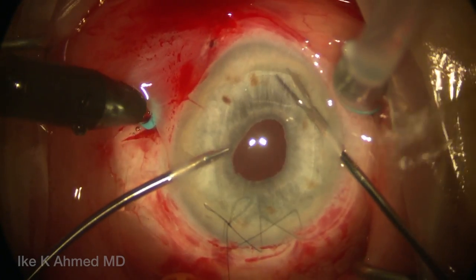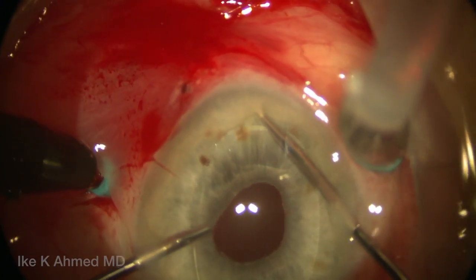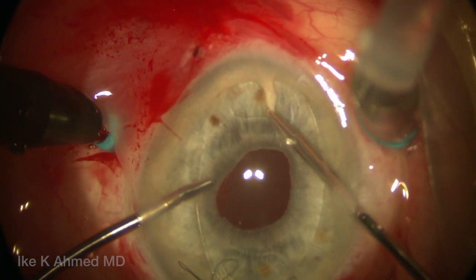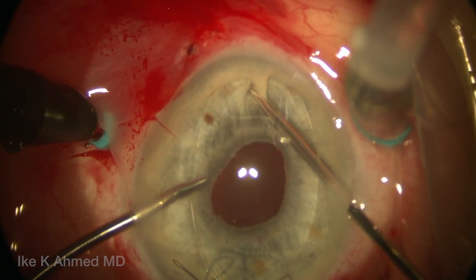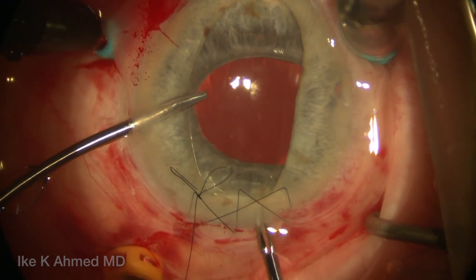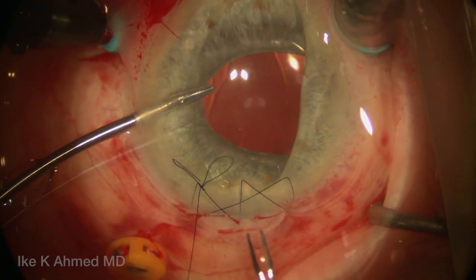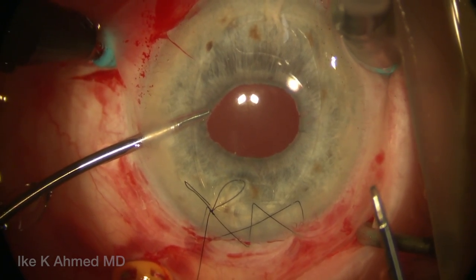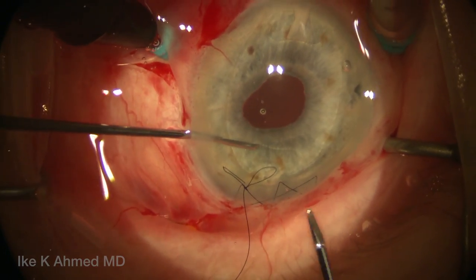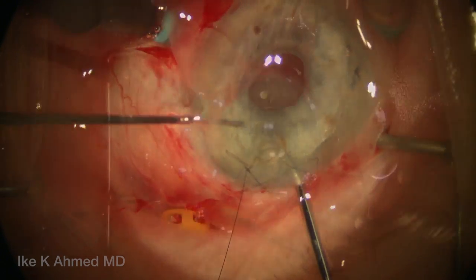To fixate the artisan lens, we have a micro-forceps on our left hand holding the optic, while a micrograsper is used to grasp the peripheral iris and pull the iris through the jaws of the iris claw haptics. The micrograspers can be used to split the iris claw, allowing the iris to be drawn up through it. We'll do the same thing on the temporal side, grasping the iris and pulling it straight up through those claws. It's important to hold the IOL in the desired position to ensure it's fixated on the iris in the appropriate location. We've got a good tuft of iris through the temporal haptic as well as the nasal side.